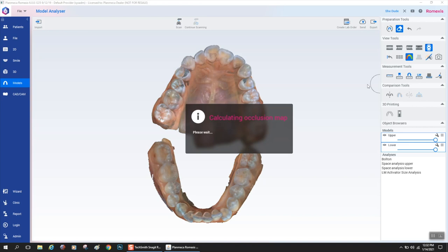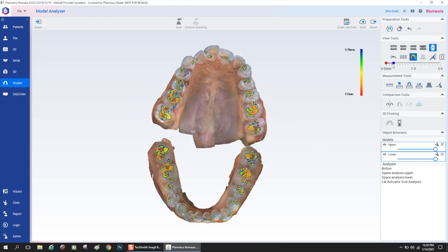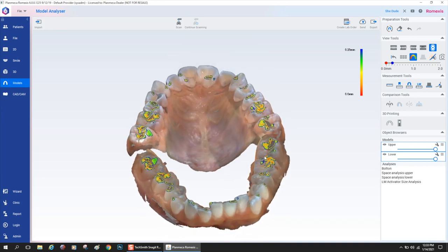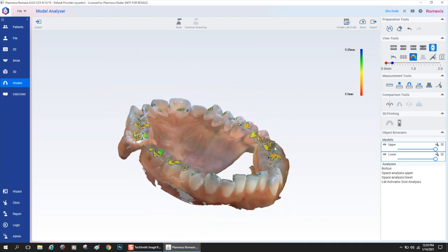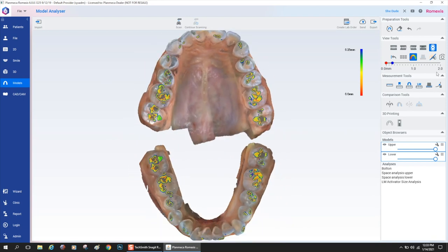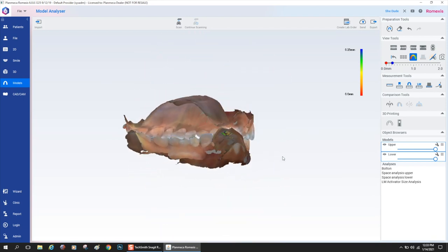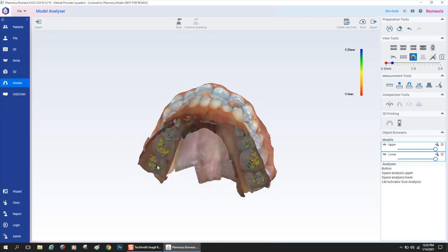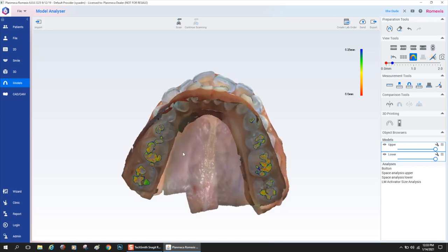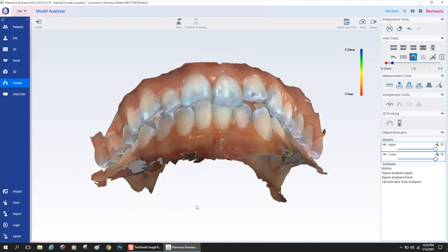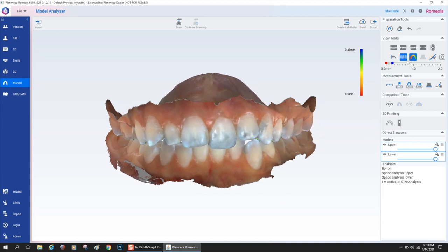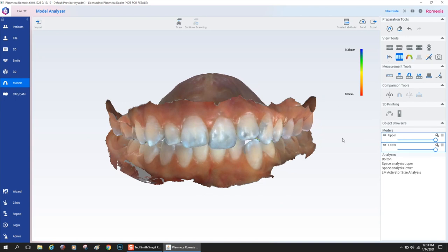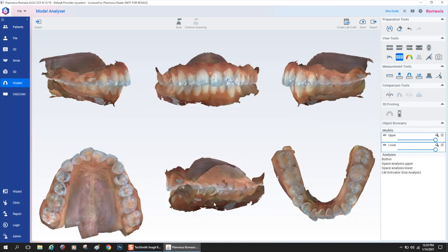The other thing that's really neat in the model analyzer feature is the occlusal analysis. I click that little occlusal icon there, and I like to drag the slider all the way to about 20 microns. You get a really good indication of the patient's occlusion during maximum intercuspation. You can see we have some really cool heat marks. I am getting really nice bites with the software. I tend to get really good articulations of the jaws.